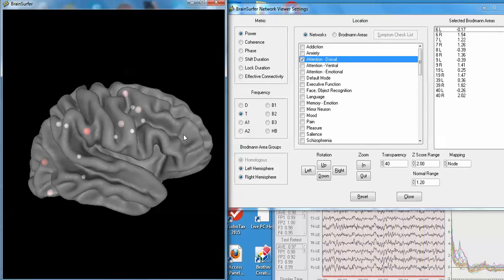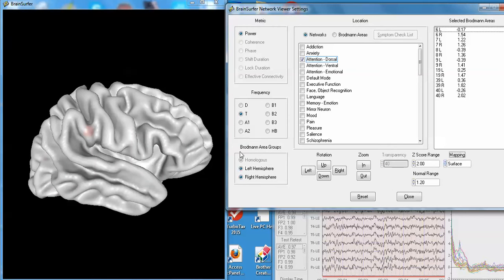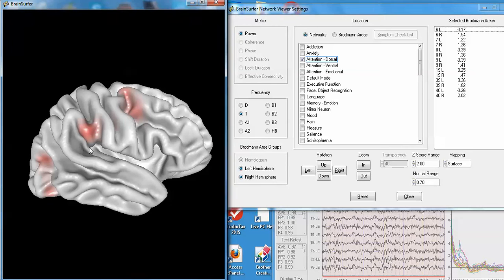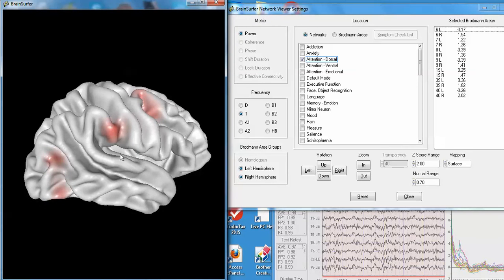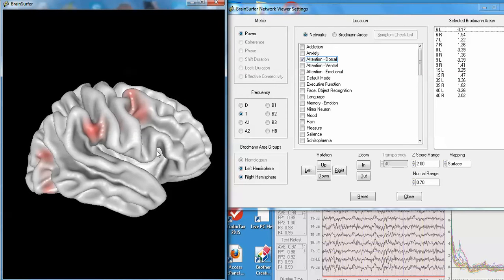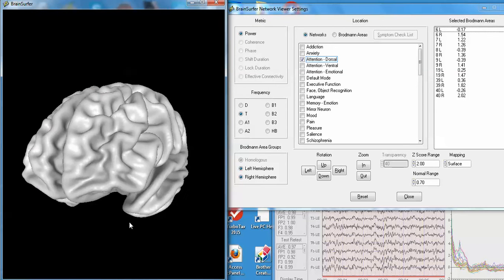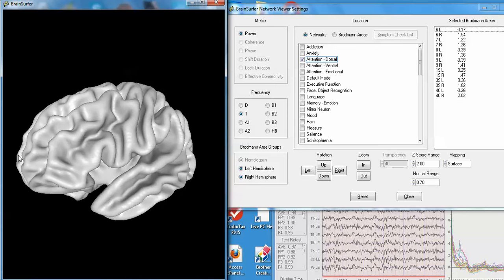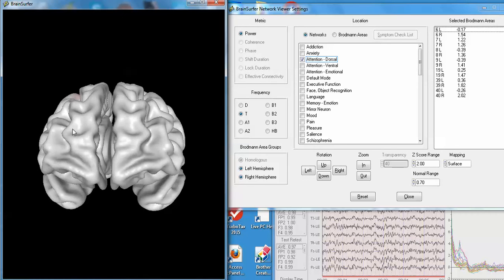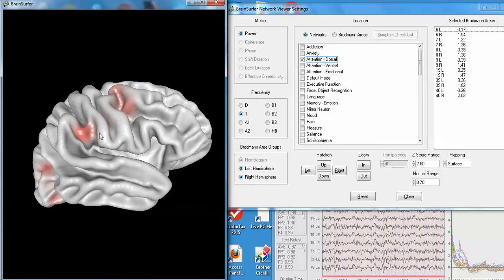You can also look at the projection of these z-scores onto the surface. We can look at that in a little bit more detail by lowering the z's. You can see that the surface is deviated from normal on the right and normal on the left because the injury was in the right parietal region.